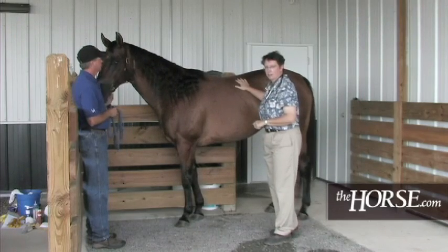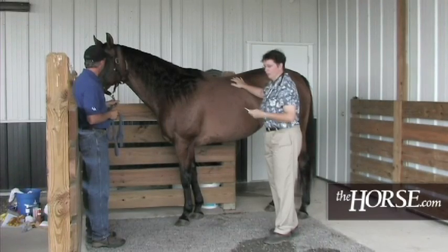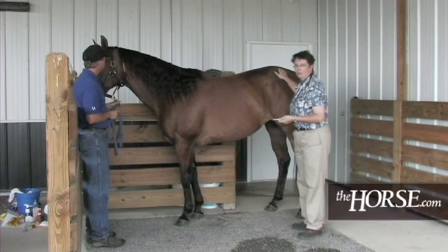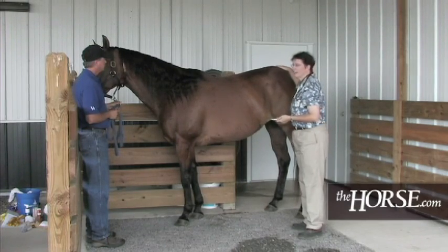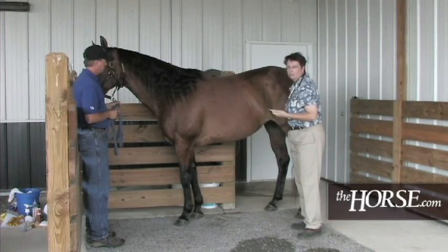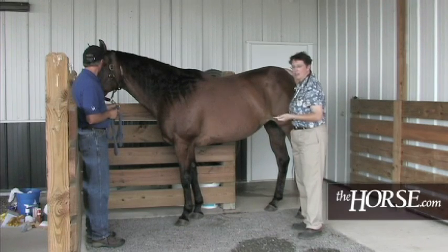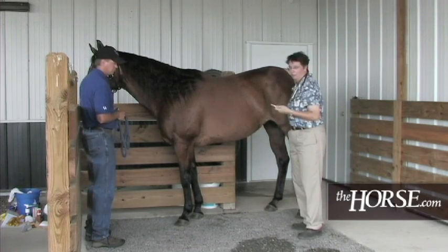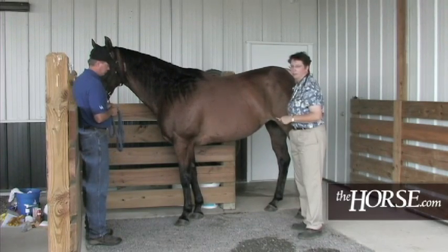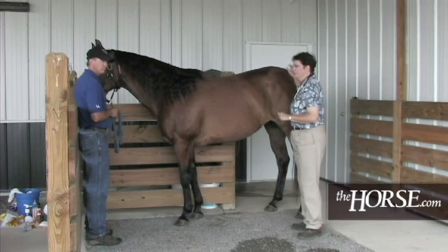Taking temperature in horses is a little different than in people. We don't stick it under their tongue — we use a digital thermometer and do a rectal temperature. This is the downfall of many horse owners who haven't gotten their horse accustomed to working around their tail. I do not recommend mercury thermometers since they contain mercury, which is toxic, and they will break. A good digital thermometer is the way to go.